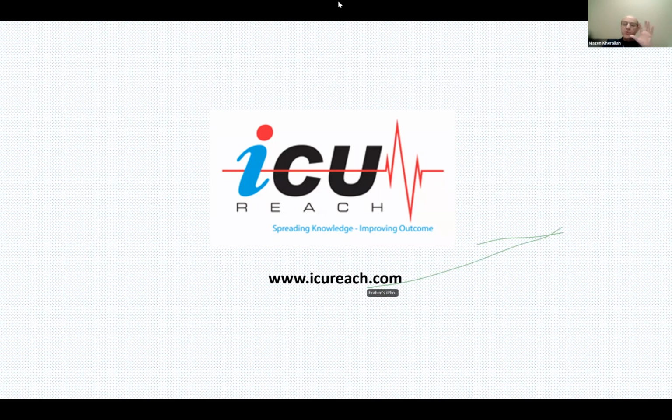I see that some of you are probably misinterpreting the first answer, which is ventilator pressure and flow. You always need to monitor the pressure and flow on the ventilator, because what I showed you is that the pressure and the flow can determine the respiratory drive for the patient, and of course can result in adverse outcomes in terms of ventilator-associated injury or patient self-inflicted injuries.